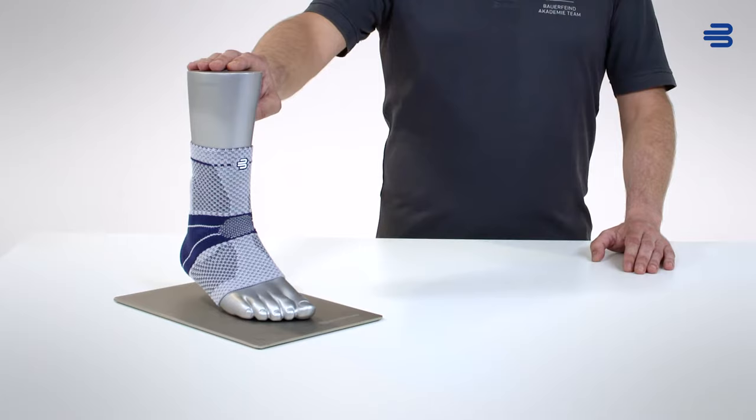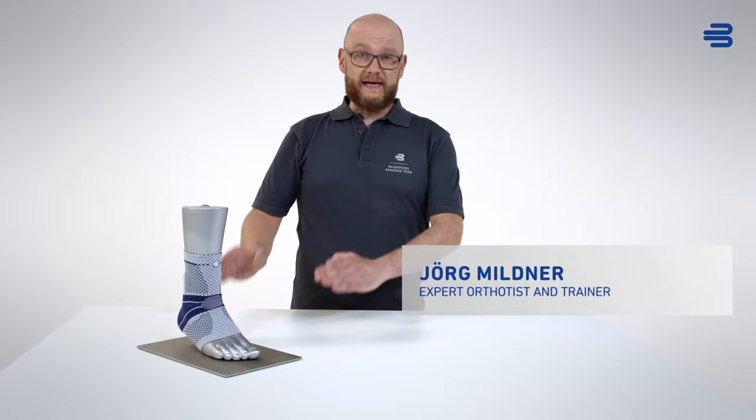Hello! Today I'd like to present Bauerfeind's Malleotrain, a highly functional support for the injured ankle that provides pain alleviation, stabilization and rapid reduction of swelling.